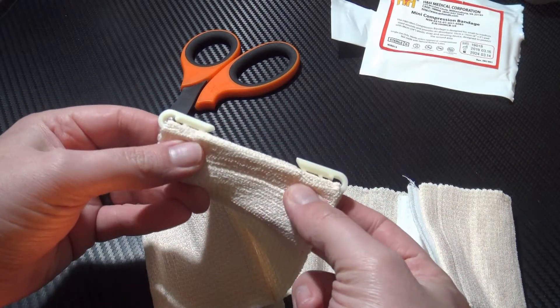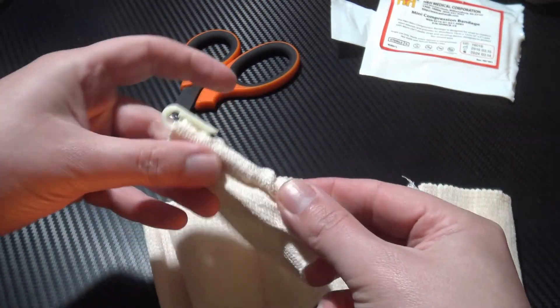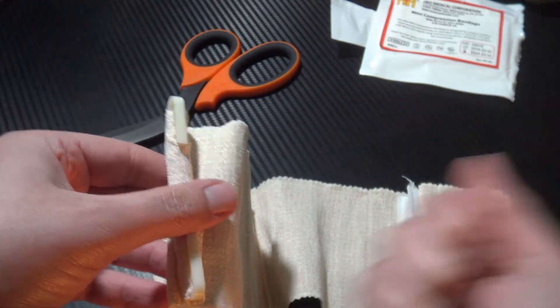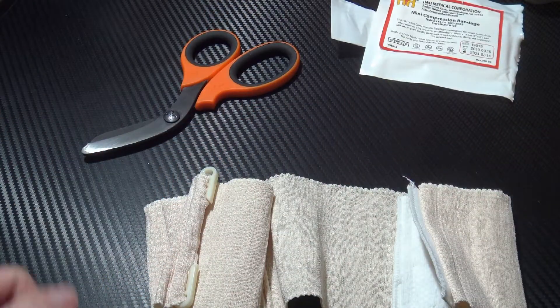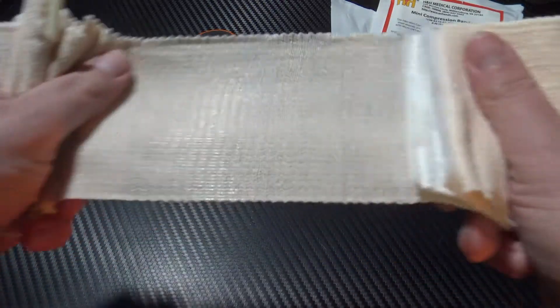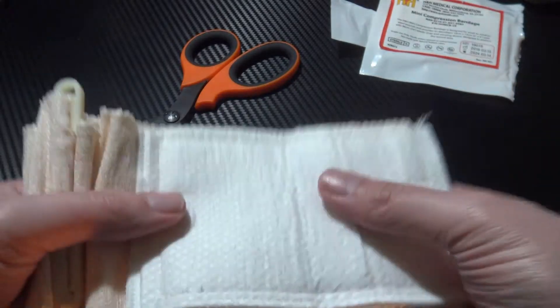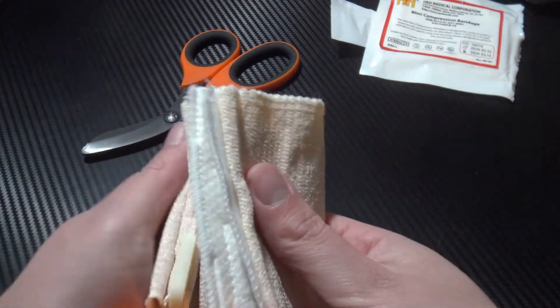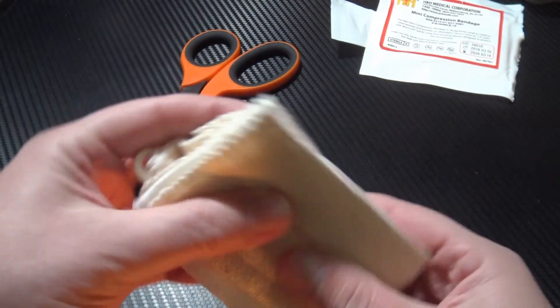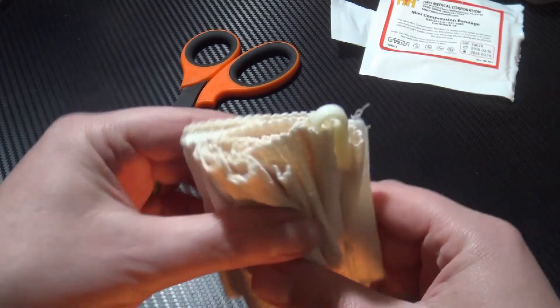You have a retaining clip — you can see the teeth there — which simply allows you to finish wrapping and securing, so you don't need to worry about it coming loose during transport. There is no pressure bar or anything like that. They have sacrificed that for the sake of it being so slim, which isn't necessarily a bad thing. If you're not going to carry it because it's too bulky, it's no good to you. So being so thin is really neat.